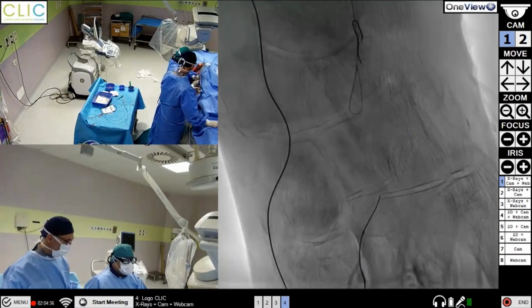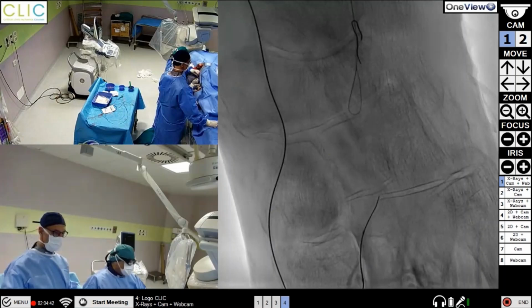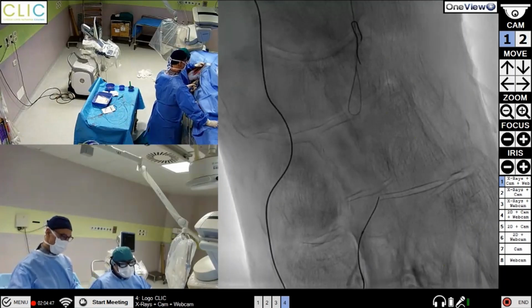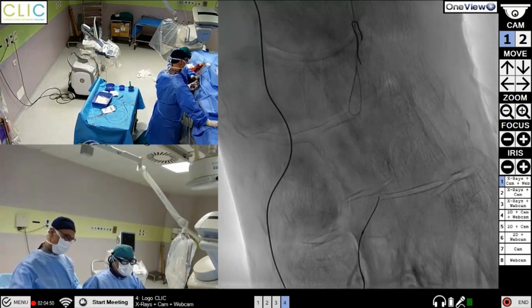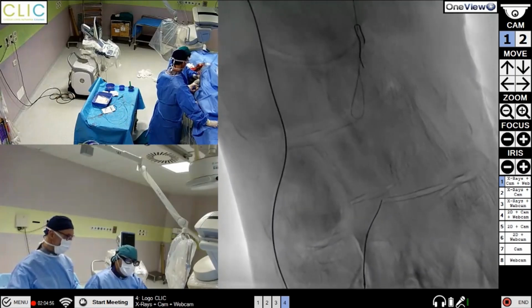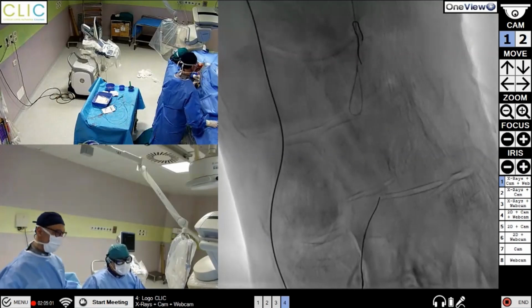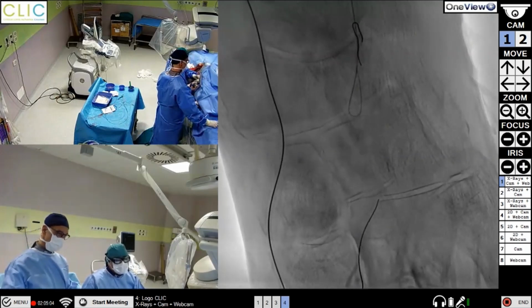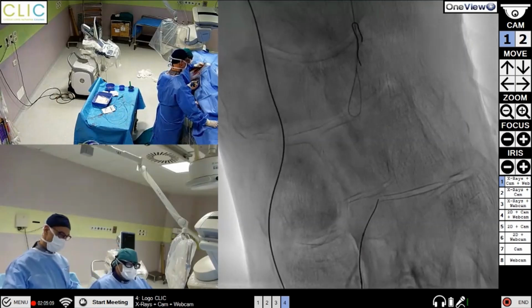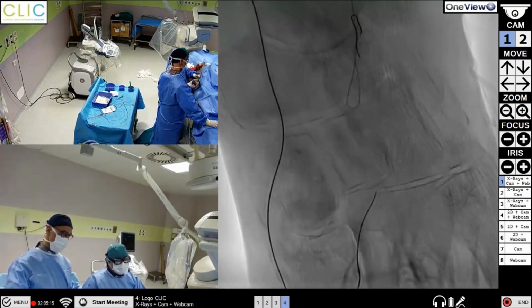Yes, I cannot do any distal access with this foot, because originally I thought, looking at the angiographic picture of the foot, the arch and the first metatarsal artery was really visible. So I thought, okay, I can do an extreme distal puncture, but it's not possible. In this moment, the wire is entrapped in the calcium. I cannot remove the wire.